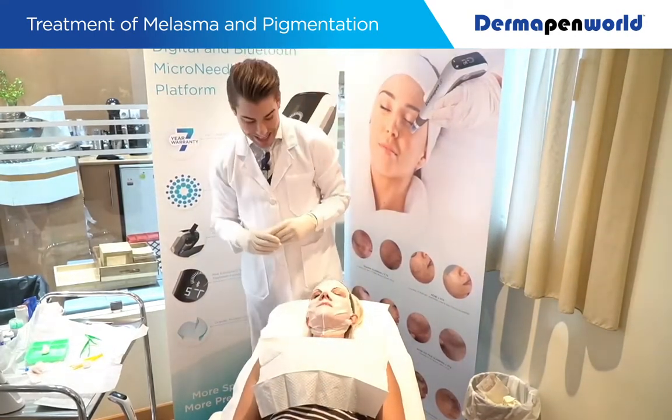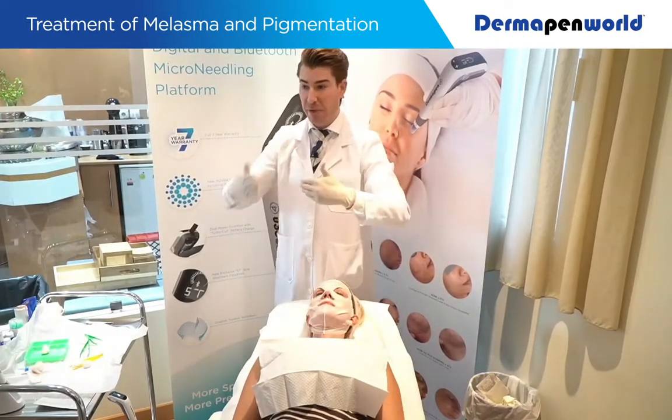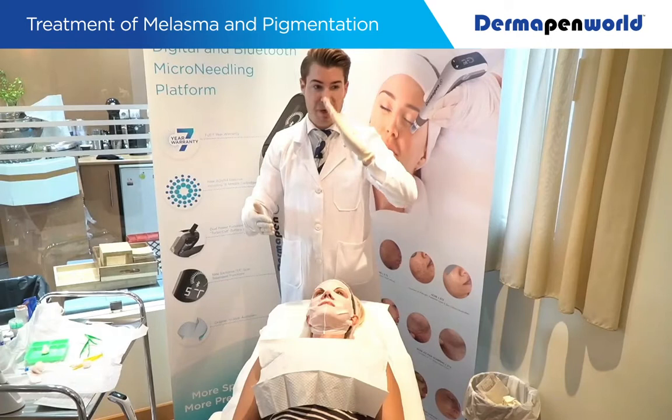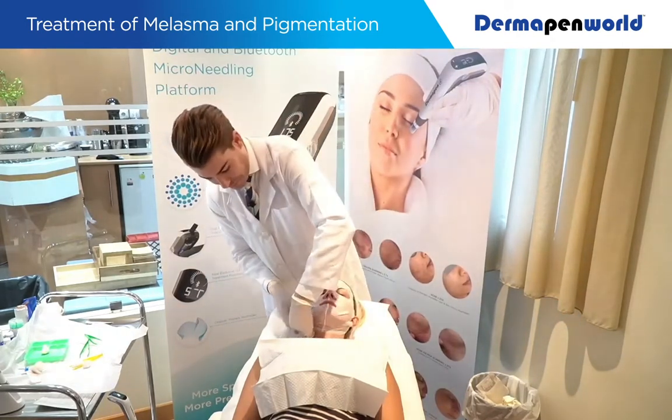Thank you. Typically, I leave the mask on for about 7 minutes. If you want to leave it on up to 40, you can, but obviously time is money and you will need the resources to do that. So we're going to speed time up.